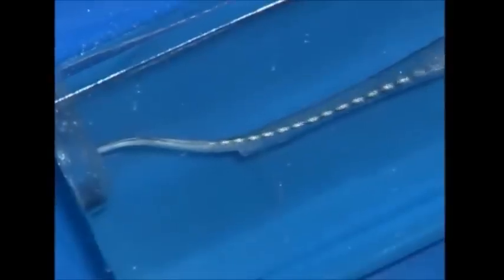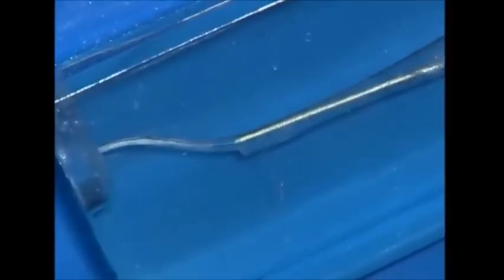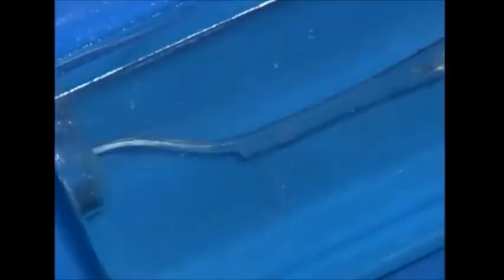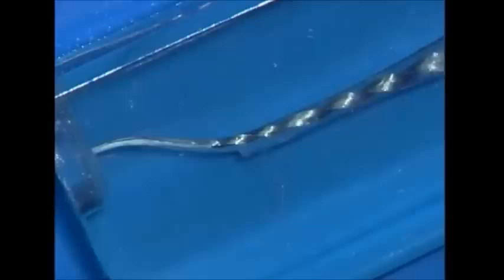The recapitulation file again is used in little deliberate short amplitude strokes to move debris into solution so that when we re-irrigate, we can liberate that debris. The next sequential instrument is the ProTaper Finisher number 1. Again, the pre-curve instrument can be readily passed through the pre-enlarged canal.